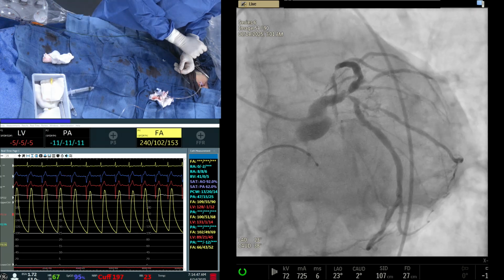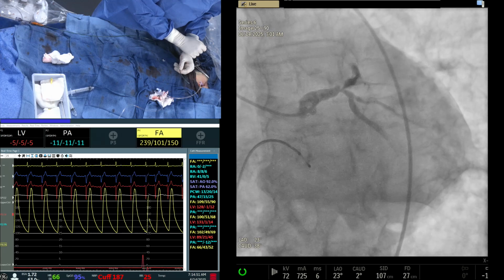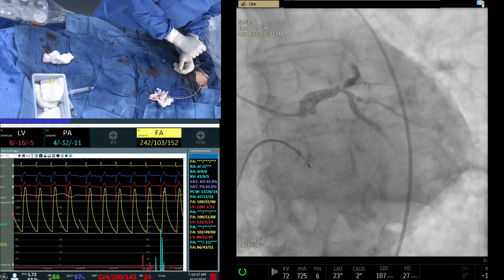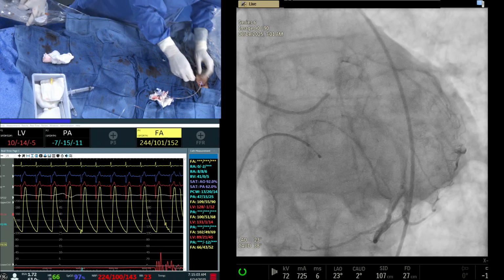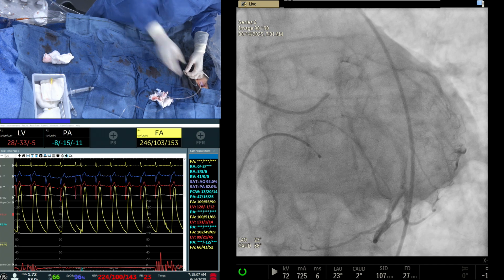Trust me, there is no landline here from us. Okay. No, mostly what I meant is your control AV people who are in the room. Somewhere in the room, they're sitting there. 1.5 bar. We are hearing the noise. Okay. Let's go. Now still pressure is high. Why is it going up now? Okay, let's finish the case.